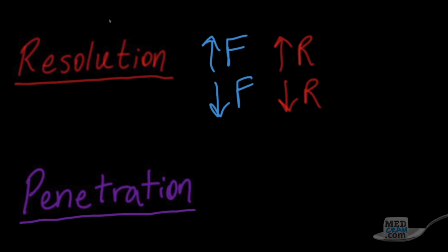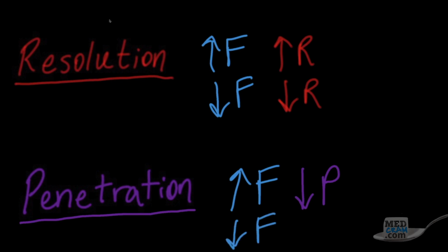Now, the converse is true of penetration. As you increase the frequency, you decrease your ability to penetrate into the tissue. And the opposite is true. As you decrease your frequency, you increase your ability to penetrate into the tissue.